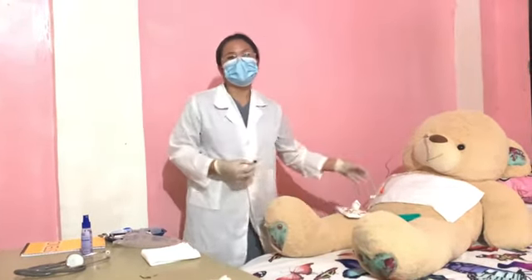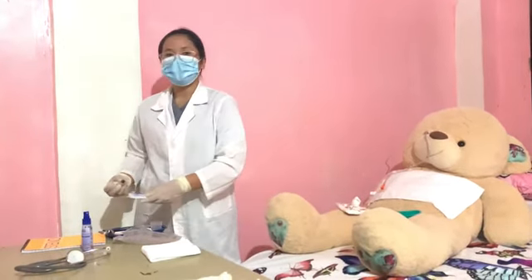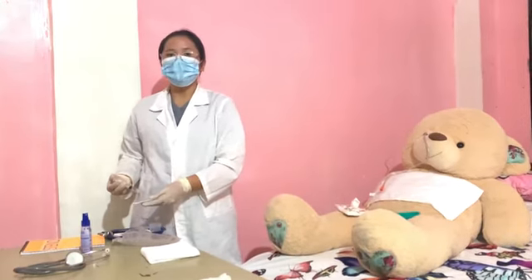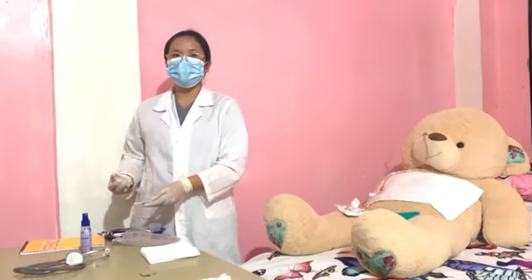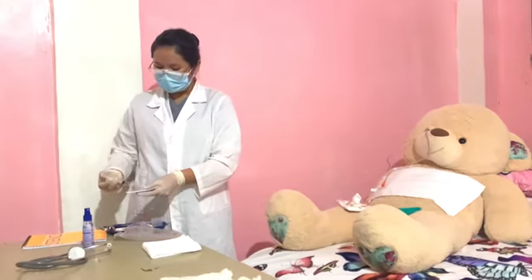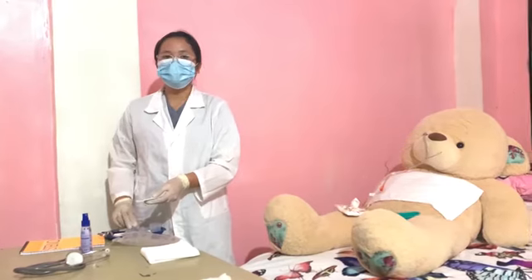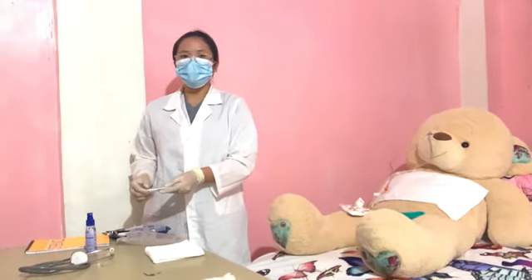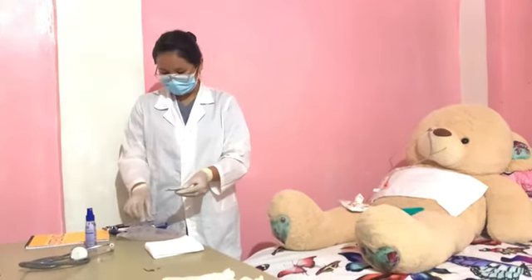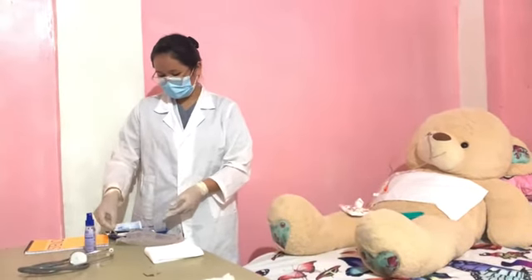This is to check the pH level of the content. And then measure the pH of the aspirated fluid using pH paper or meter. Place a drop of gastric secretion onto the pH paper or place a small amount in a plastic cup and dip the pH paper into it. Okay, I'll drop na po. Within 30 seconds, compare the color on the paper with the chart supplied by the manufacturer. Okay, we have obtained 3, which is a good indication.